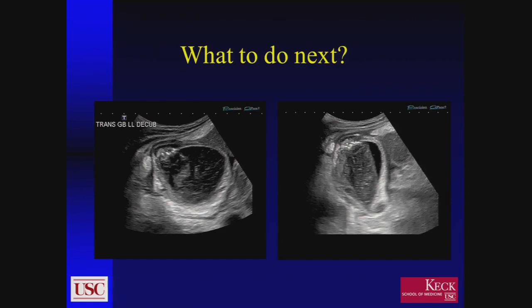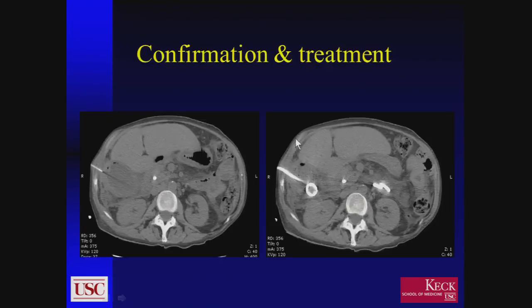And in fact, that's what we suspected that this woman had. She was not in exactly great shape to go to surgery, since she, as I said, was on the transplant list, very close to being transplanted. So what we wound up doing with her was taking her to CT. On CT, you can see that there's confirmation of this air within the wall, and so we put a cholecystostomy in her under CT guidance, drained a lot of pretty gunky looking material out of her gallbladder, calmed that situation down, and she was eventually transplanted several weeks later.